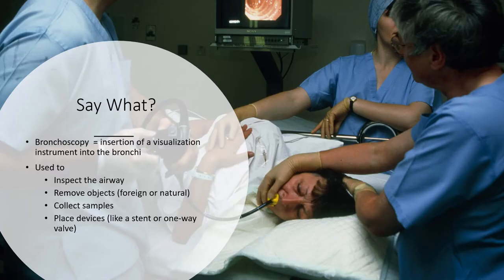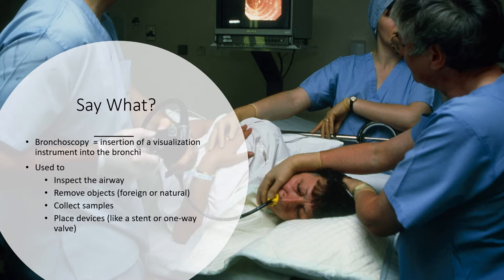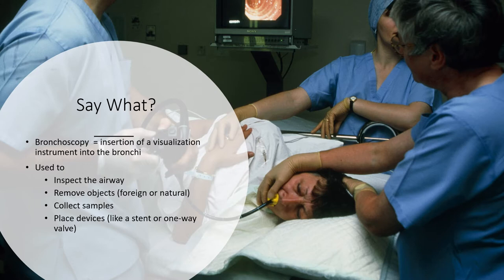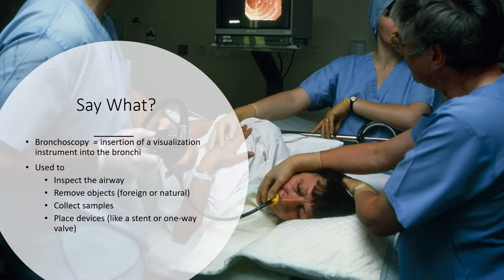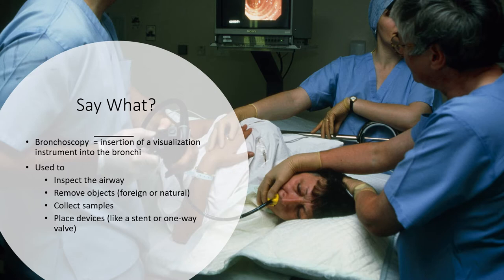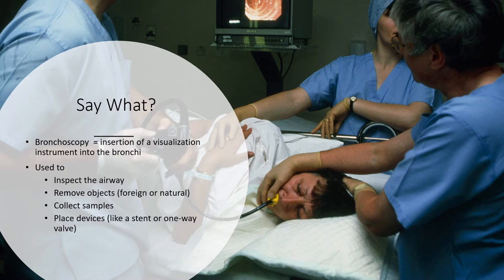Bronchoscopy is basically the direct visualization using an instrument into the bronchi to see where something is or what something looks like. It allows us to sample material as well as remove material. So it's diagnostic and therapeutic — we're using a camera to look, and if we need to retrieve a sample or material, or even insert something like a one-way valve or a stent, we have a lot of flexibility.